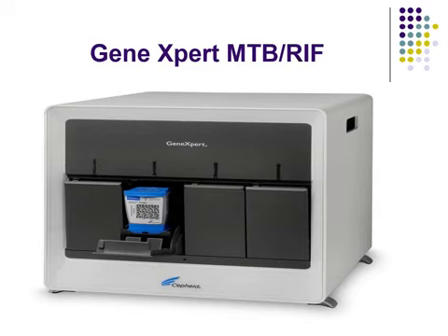This is GeneXpert, a simultaneous rapid tuberculosis diagnosis test. It is diagnosis and at the same time used to detect sensitivity.